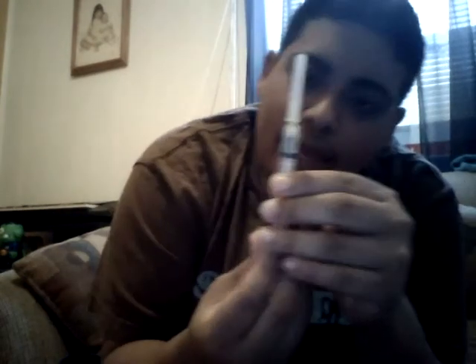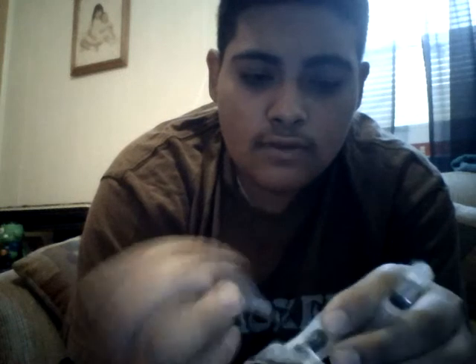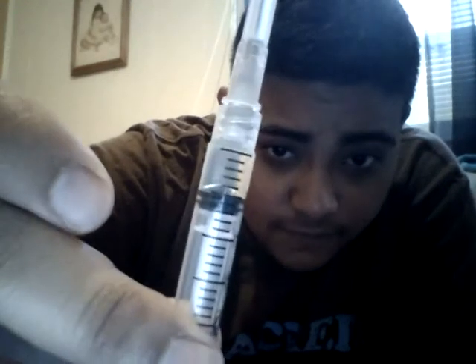Now you just pull back because there is some testosterone there. Take off the old needle, because we don't need this anymore. Open your other syringe and screw it on. Push up any remaining testosterone. There's no bubbles in there — you can kind of see — there's no bubbles at all. So that's good.